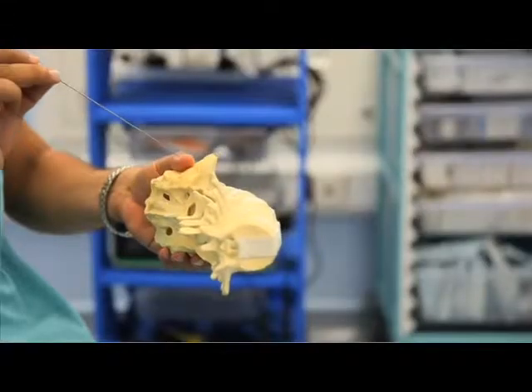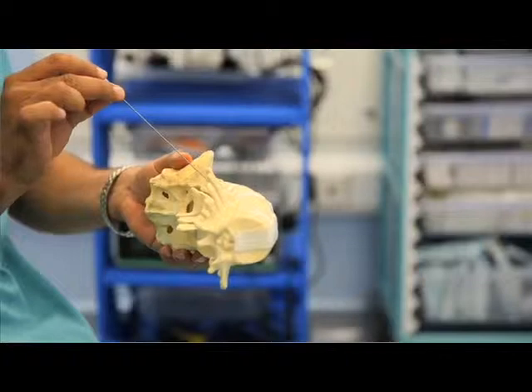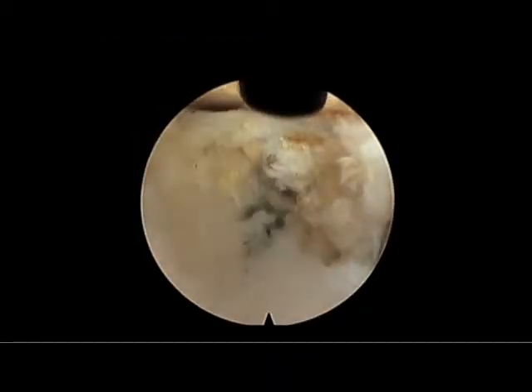Patient is usually placed in a sleeping position, lateral position, and then under X-ray control, I place the needle into the disc which is causing the problem, and then subsequently we place the camera, which is called the endoscope, and then we watch on an HD monitor, and then we shave off the disc and we decompress the nerve root. And because the patient is awake throughout the operation, we get direct feedback from the patient. And we usually stop the operation when the patient says the pain in the leg is completely gone and the patient is feeling fine.